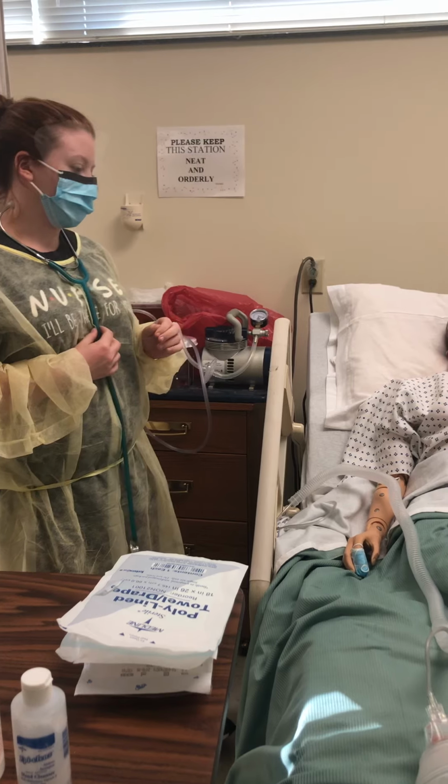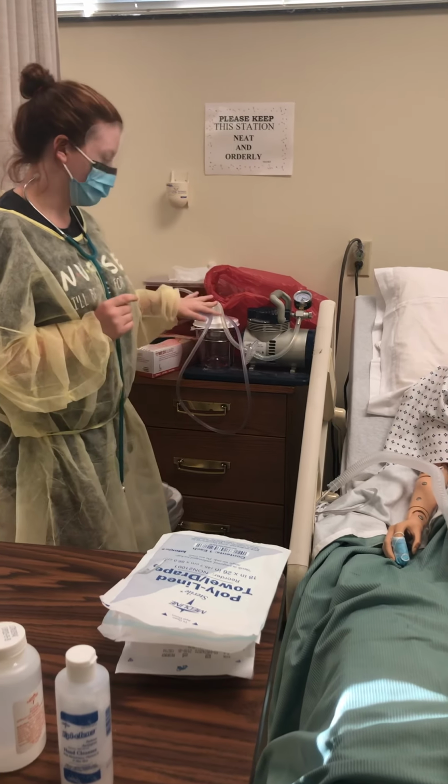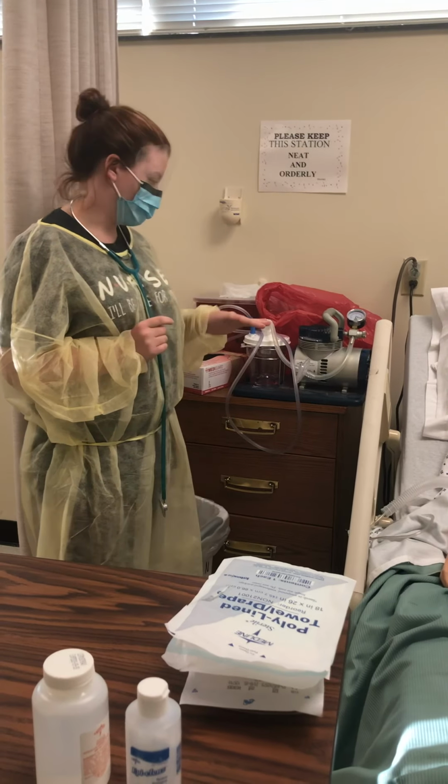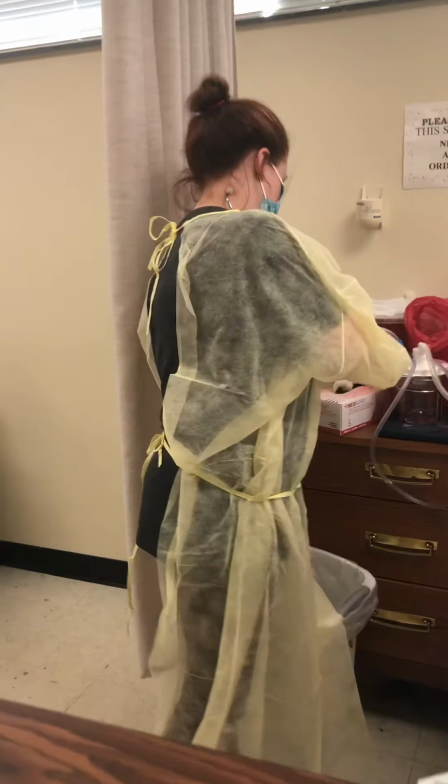Next, I'm going to check the suction and make sure that it is working properly. So I'm going to go ahead and put on some gloves.